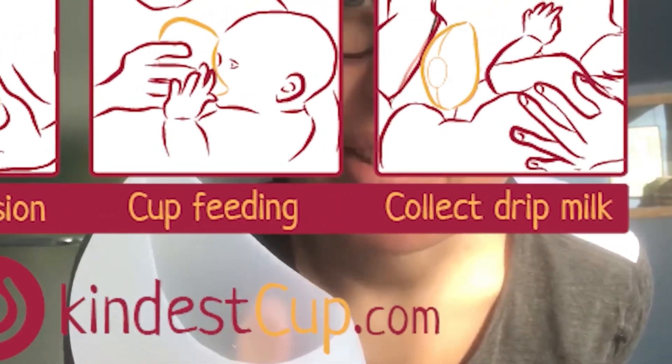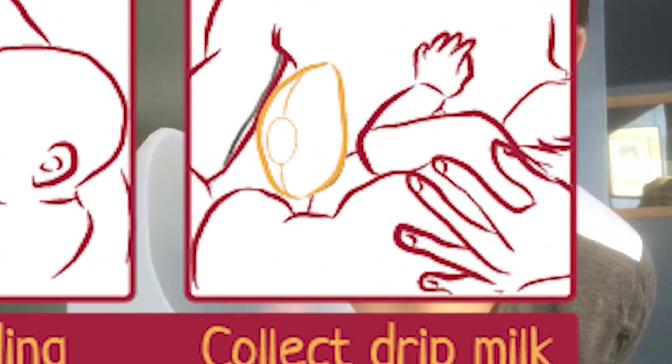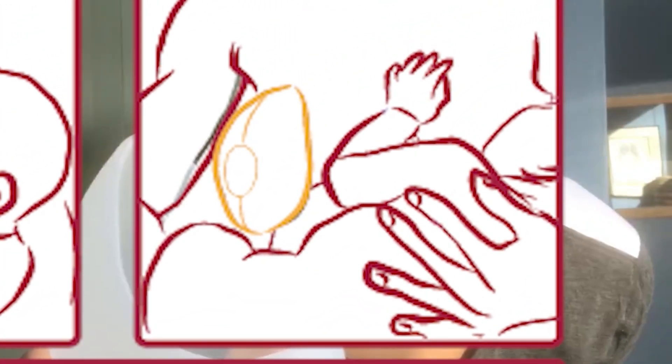Hi! Today I'm going to demonstrate the Kindest Cup Latch. That's when you use the Kindest Cup to suction to your breast and collect any drip milk that is leaking from your breast.